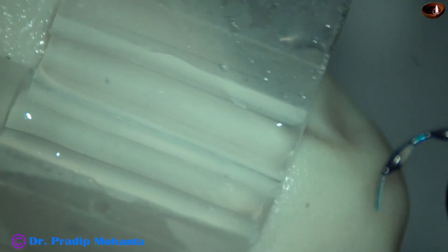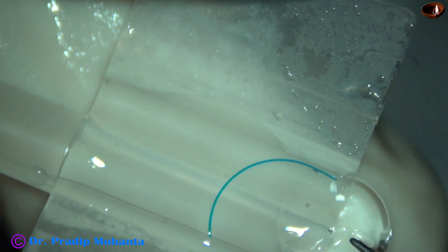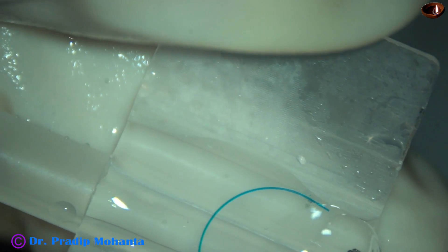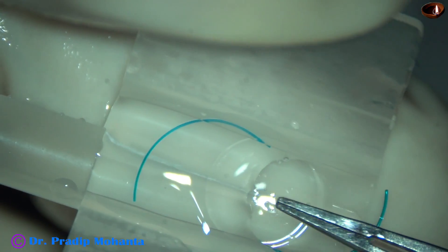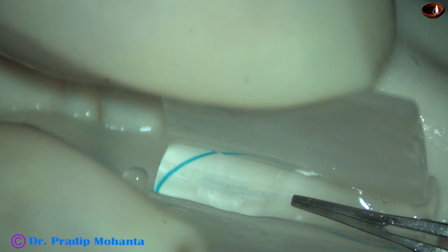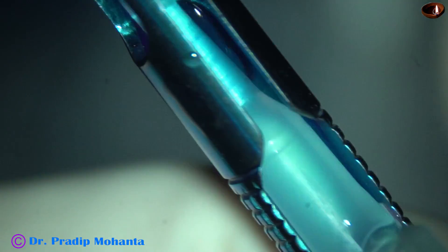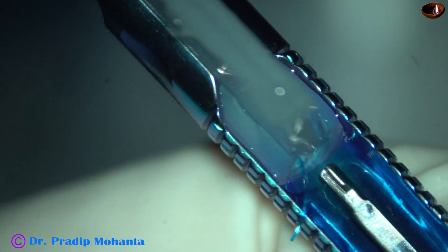This is the lens. It goes in the groove — both the haptics. The optic is pressed. The leading haptic goes in the lumen of the cartridge, and now it is placed in the injector. The piston is advanced.